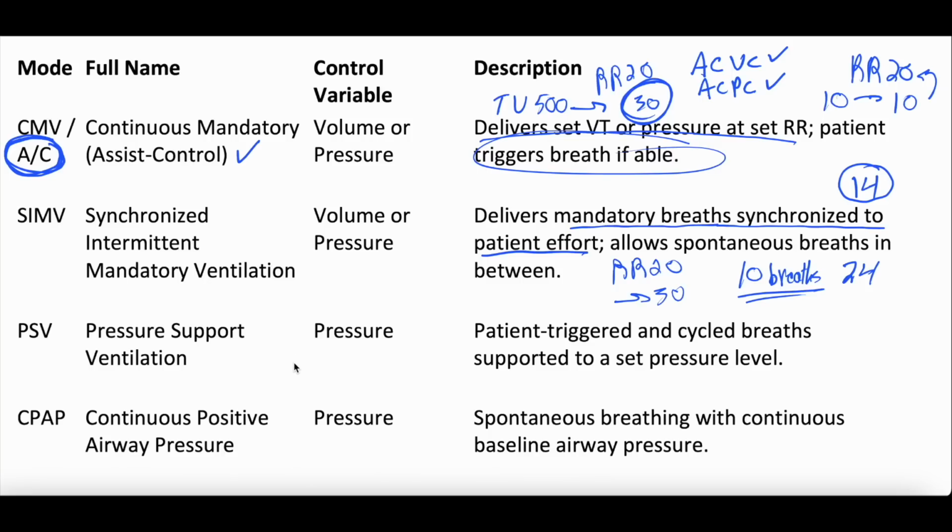Now, there is usually an inspiratory pressure, and this is an important concept. It's a little tricky, and again, this is just an introduction to the nomenclature. But on a pressure support trial, you will have a PEEP. Remember, a PEEP is a positive end expiratory pressure, and that PEEP is typically 5. But you also will have a set inspiratory pressure. And it's usually 5 above the PEEP, or you can use 7. You can set it to whatever you want to. And this is a little extra inspiratory pressure the ventilator will give when the patient takes a breath.